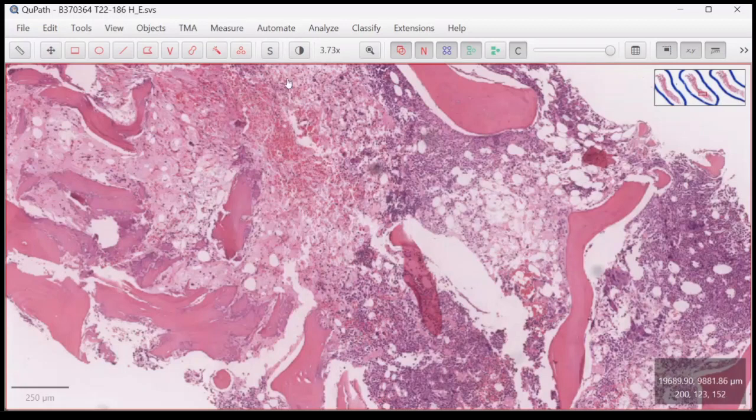We got the stromal edema actually being replaced by proteinaceous material. They are sort of obliterating the fat spaces. If they are predominant, then just indicate they are post-chemo changes. Then after this, you get followed by erythroid colony.